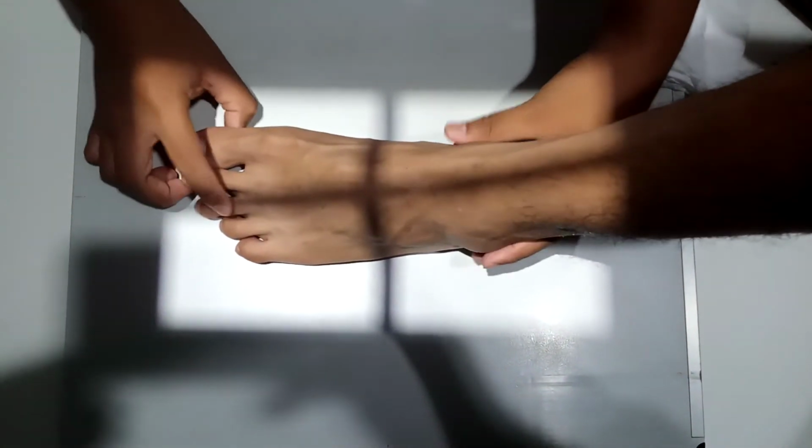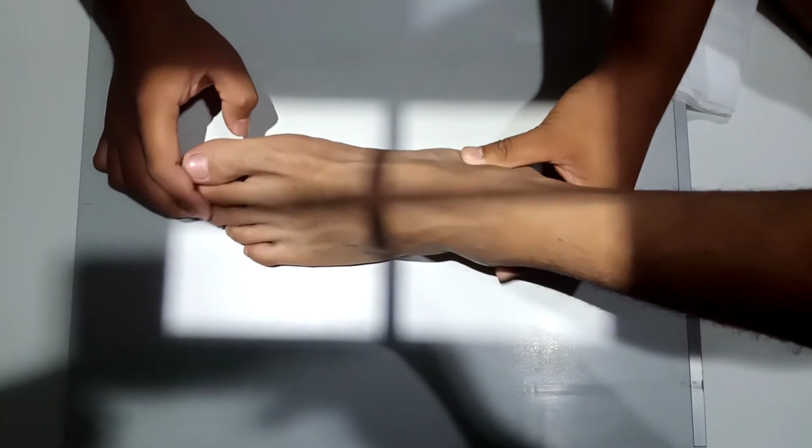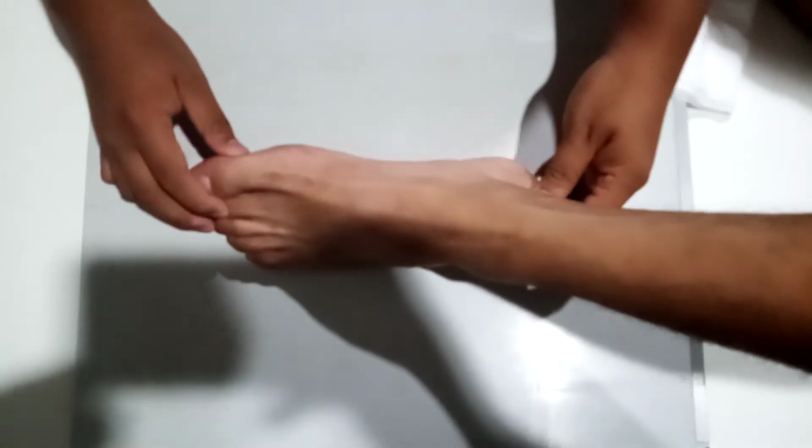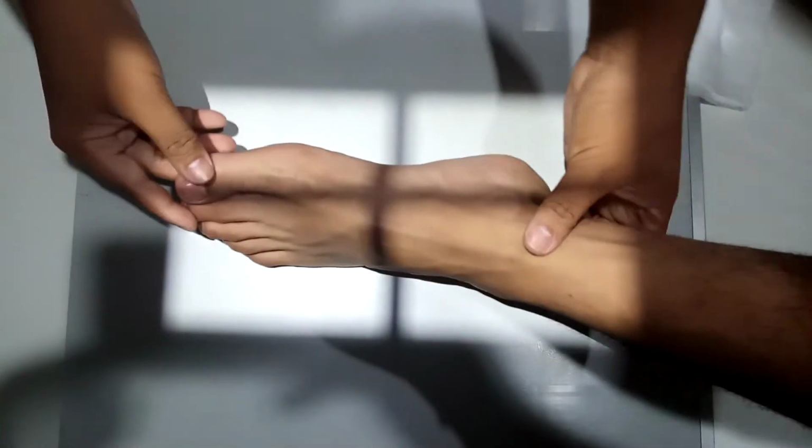Ensure that the patient's foot is placed flat on the IR and aligned lengthwise to the portion of the IR being exposed. Rotate the patient's foot medially at a 30-degree angle to the plane of the IR. We need to rotate the foot at a 30-degree angle.